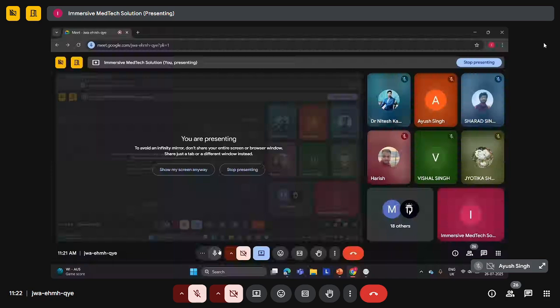In the second coming session, we shall focus on how to work on an orthopedics data set, how to work on a cardiovascular data set, and how to do tumor detection. Furthermore, since many of our participants are from a research background, we will cover how to use the software to generate reports and export the STL file that can later be used for FE analysis or CFD analysis, whichever is required. We shall also see the designing, code of operation and uses.